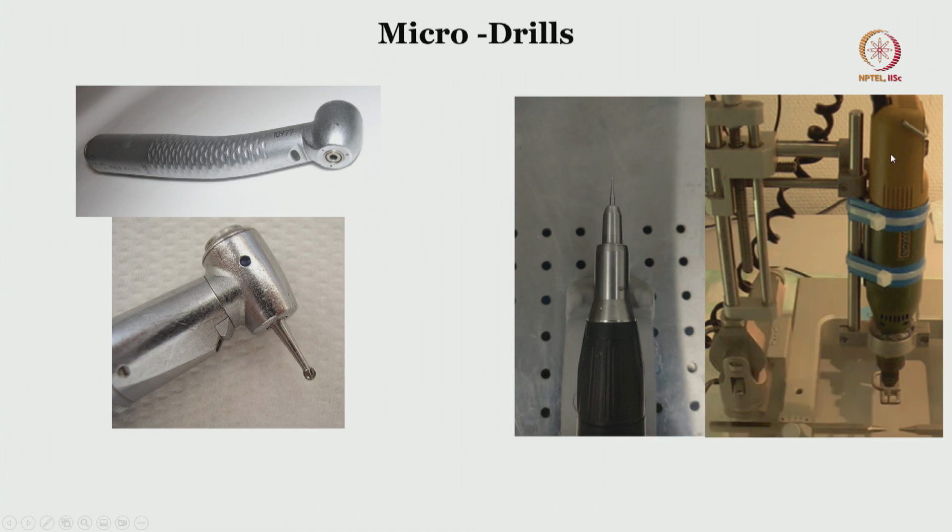On the right you can see that this coaxial system of drill has been mounted on the stereotactic apparatus. But it's not that practical. For example, you will not be able to see the skull which is in front of the adapter. Nevertheless, for a beginner who needs a little more training, it is always safer to use this sort of adapter, where you can use the micro manipulator of the stereotactic system, which can drive axially up and down without any extra movements.